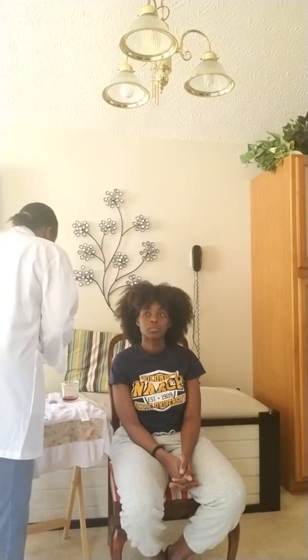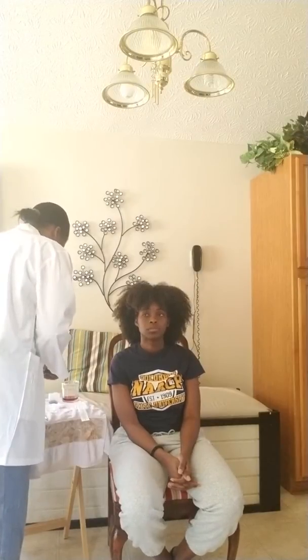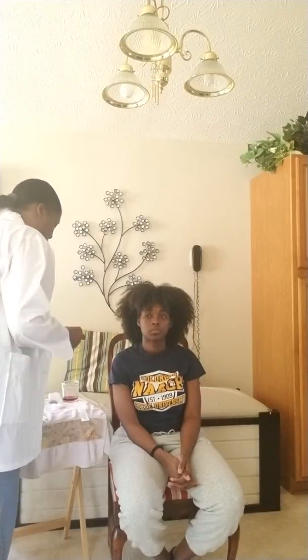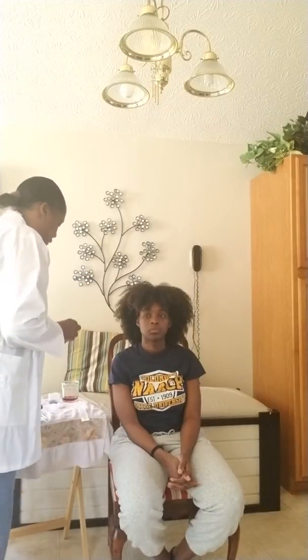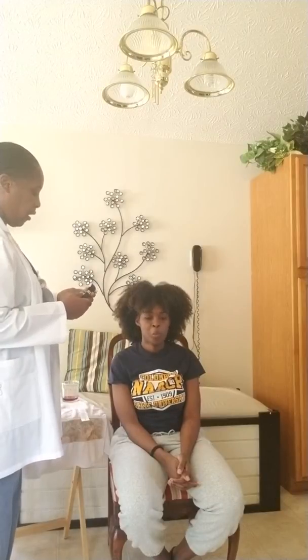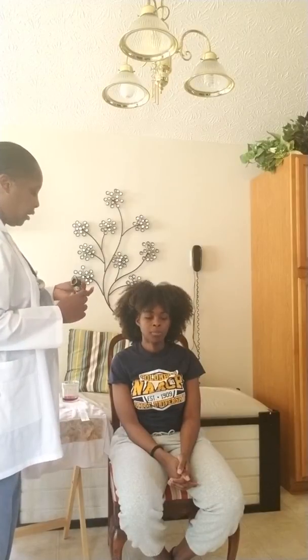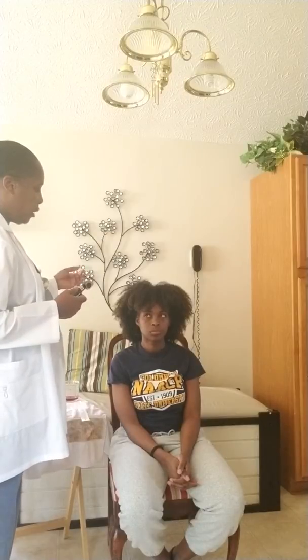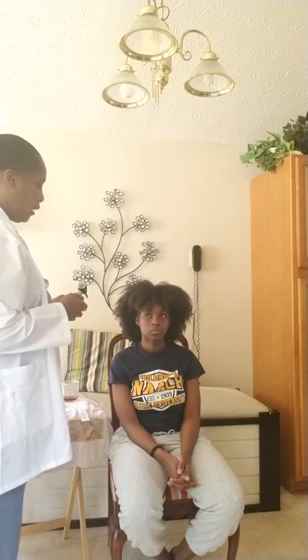And with the ear exam, we use what we call an otoscope. And they do have different sizes of the pediatric and adults. And if somebody's ear canal is small, you want to be careful how you go in. With the adult, you want to pull up and back, so that's what I'm going to do with her ear.